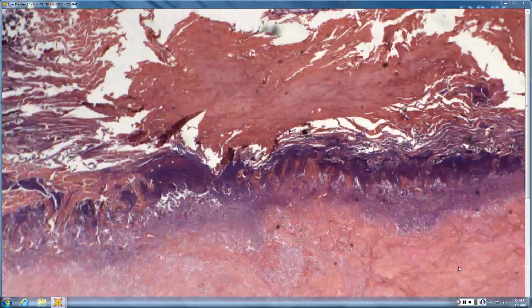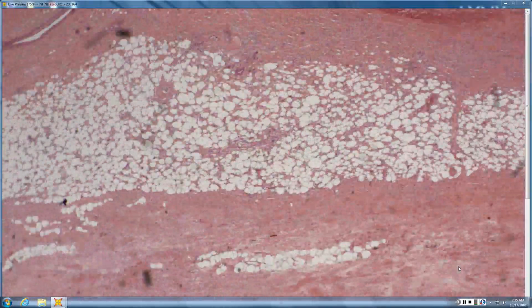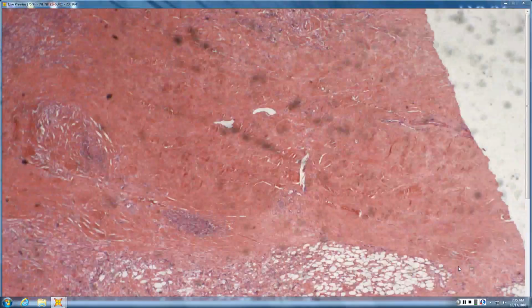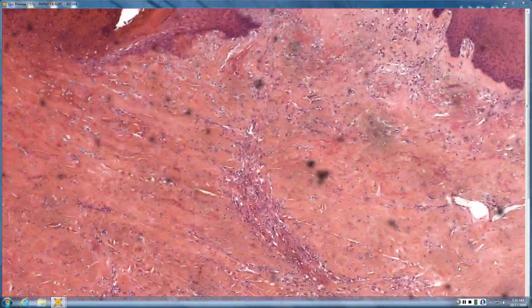Sure. So there's a large ulcer. Yep, with a tiny bit of epidermis, and then the inflammation seems to go deep into the subcu and maybe even into some of the, maybe that's fascia. Yep, down there. Okay. So first thought I would be thinking like a decubitus ulcer of some sort. Yeah, so there's some sort of big, deep, nasty ulcer in the adjacent skin.